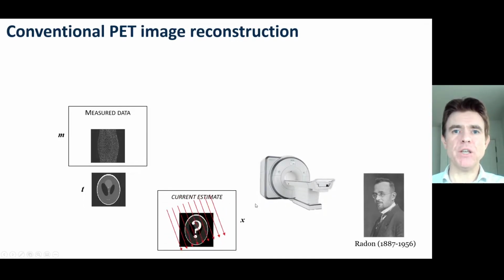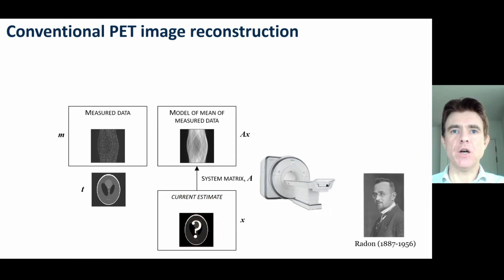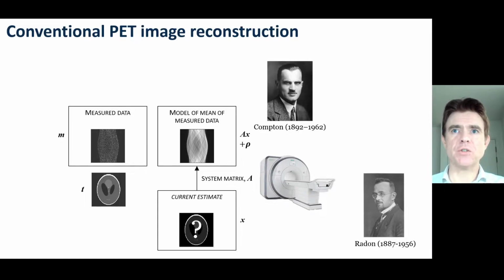And what we'll be doing is, for example, applying a radon transform forward model along with many other components according to your system matrix representing your scanner, modeling your scanner. So that would include positron range, it would include effects such as scatter, which is what I'm showing here, that we could have a line integral forward model. We could include attenuation, normalization, add-on scatter and randoms in the context of PET.